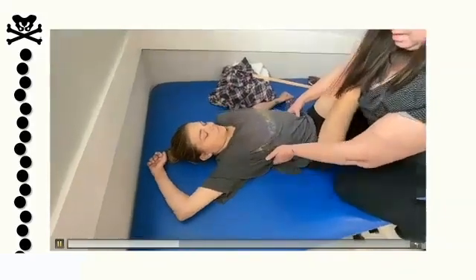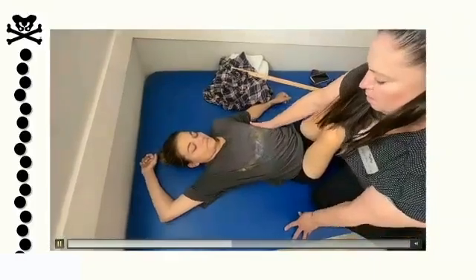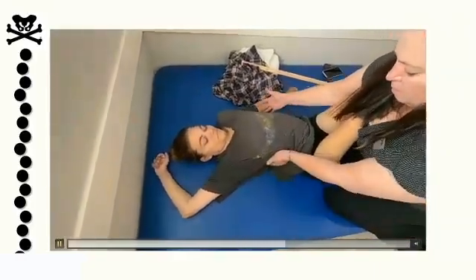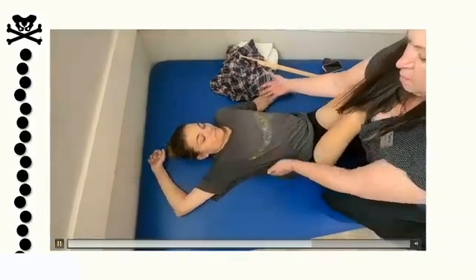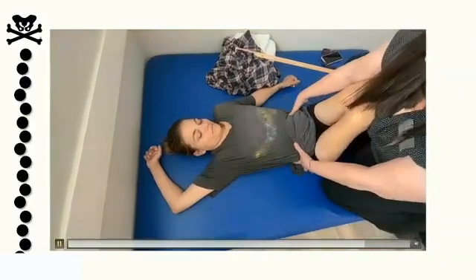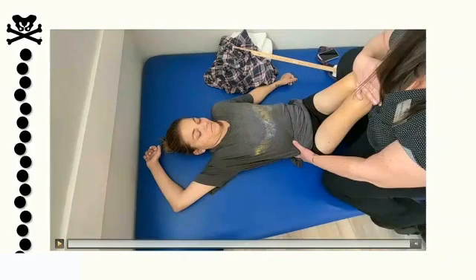And then I'm also going to check the rib cage and see if there's more flexibility in one direction than the other. And the same amount of pressure really results in a lot of movement here and not quite as much movement there. But she is hypotonic, and so she does have generally a lot of flexibility.